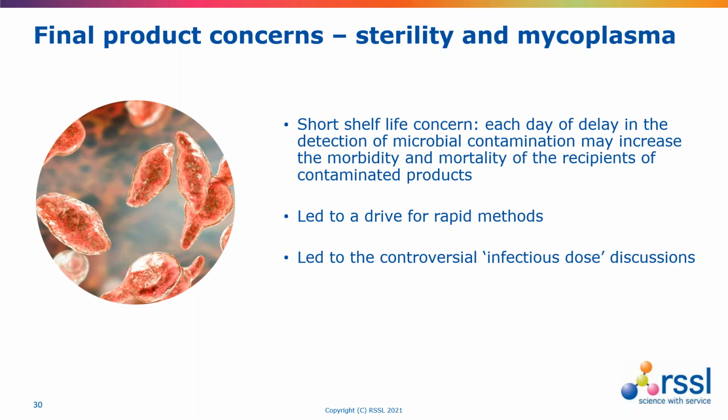And another important area, so come on to mycoplasma in a second, is the importance around the actual sterility test as well. So one of the concerns is that a number of products need to be used in advance of the sterility test. So either that's something that has to be accepted then reacted to, or there are the emergent rapid microbiological methods.